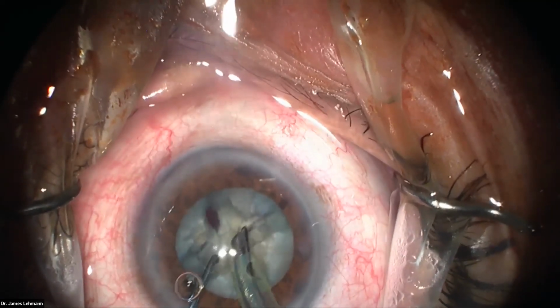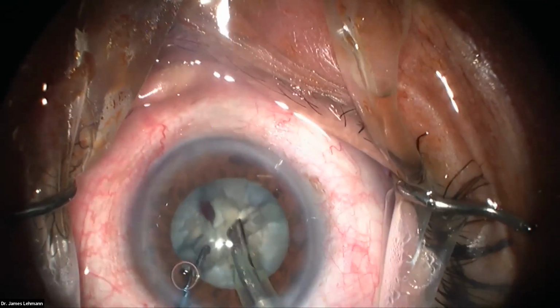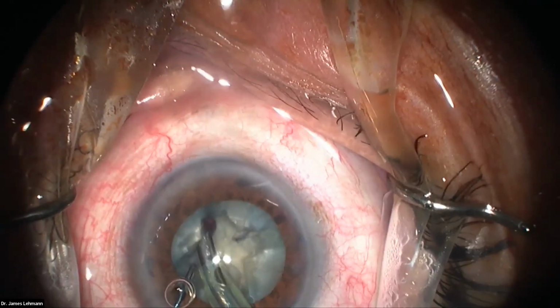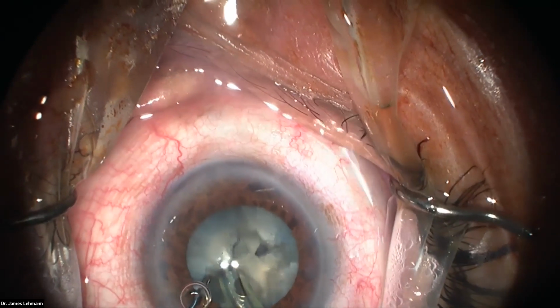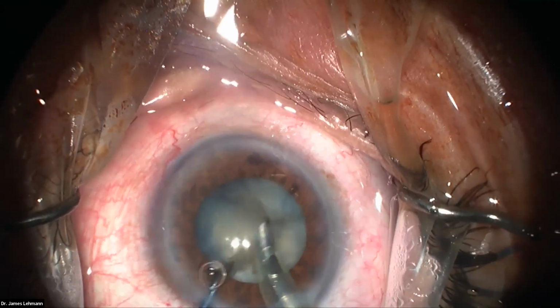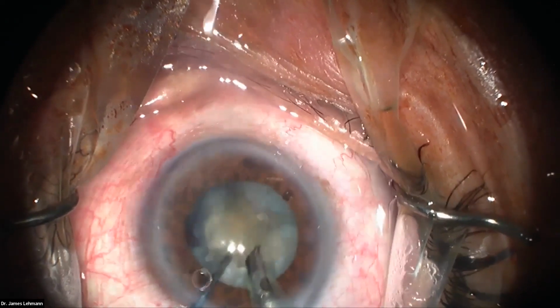So I'm switching to peristaltic quadrant mode, and then I'm turning the phaco tip 90 degrees like that. And then I'm putting it to completely occlude the ostium of the phaco tip. And now I'm not increasing my vacuum. I'm just pulling out that little piece. And you kind of want to see it's kind of stuck there. No, here it comes. All right, now it's freed up.